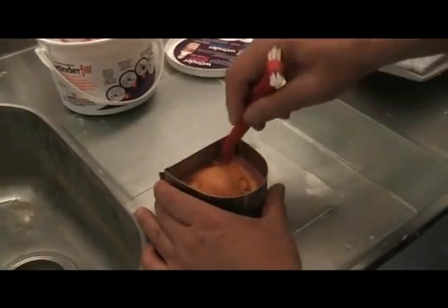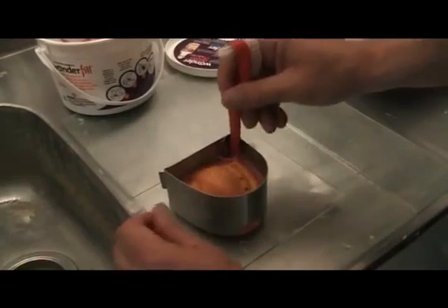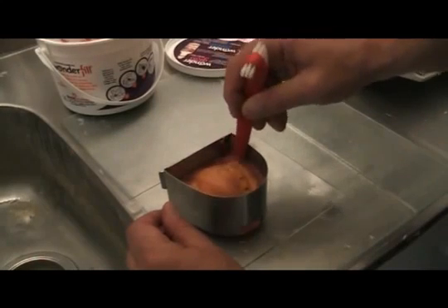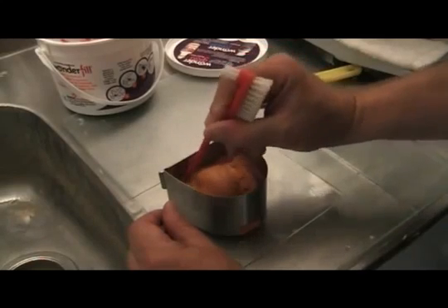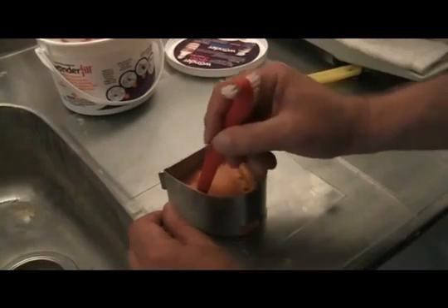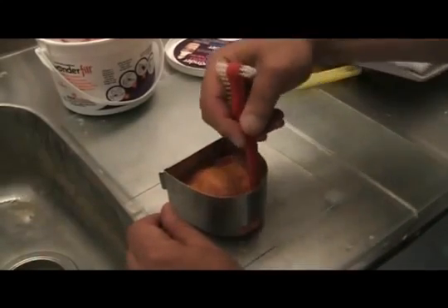And you can see what I've done, just for the sake of being neat, housekeeping, I'm tamping it around the hamular area and making sure that the material is below the hamular impression so that I have a bit of a land area that will hook around that hamular notch. Well, there it is. I'm complete. I don't know if you've been looking at your watch, but I would imagine that I'm under 5 minutes with this.